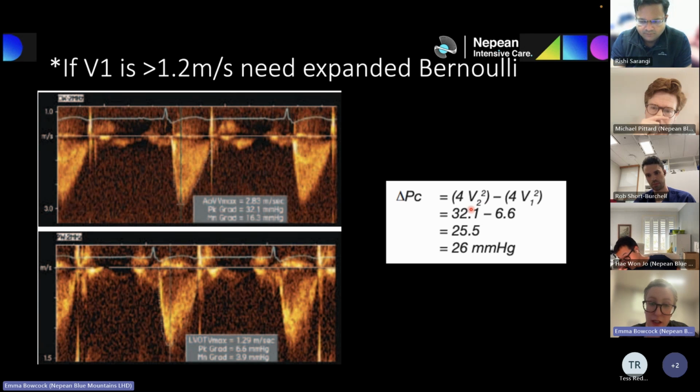Now, the guidelines basically say that we probably shouldn't apply this for mean gradients. I don't know, but anyway, in Benita's book, she does do the same thing for correcting for the mean gradient, which would be 16 minus 4, which would give us a mean gradient of 12 as opposed to 16.